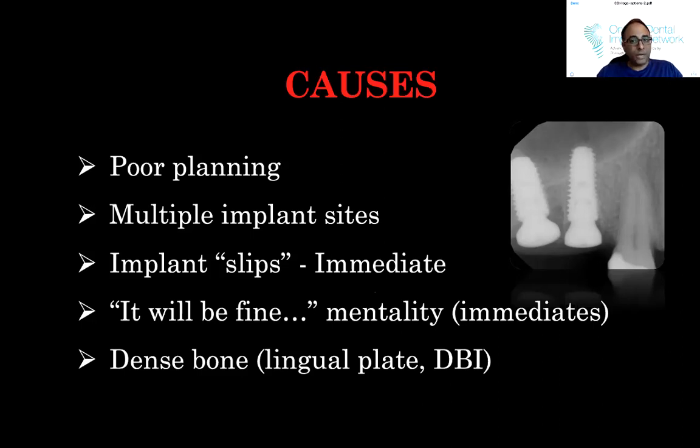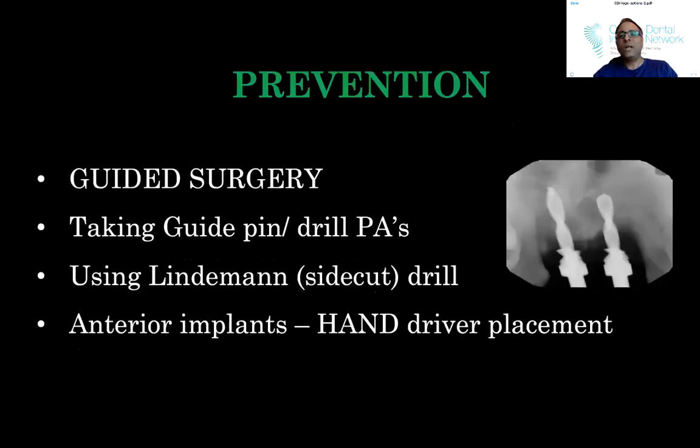Or even the lingual plate, for those doing guided surgery with something like a one guide where there's an open channel, your implant might get deflected buccally. So you need to be aware of that. So how do we prevent a poor position?